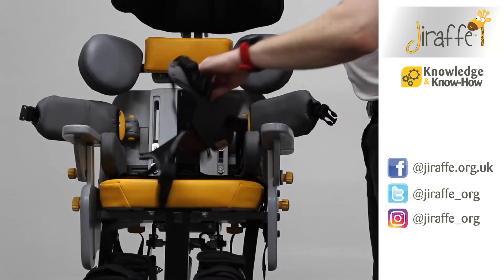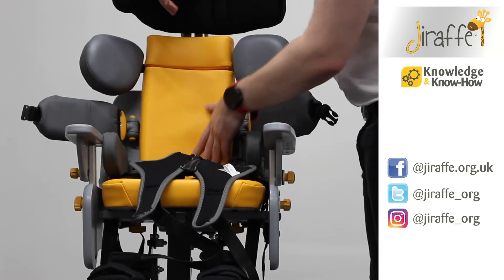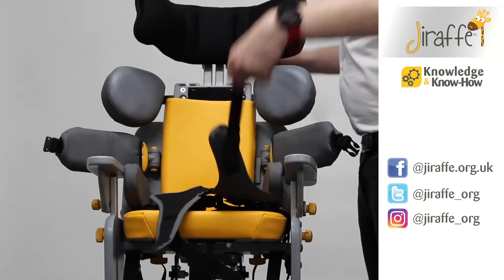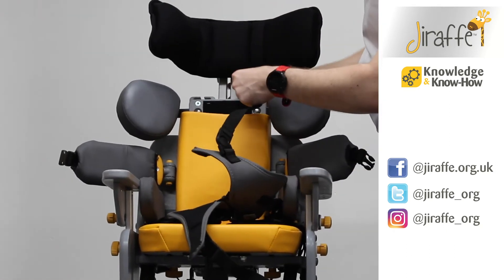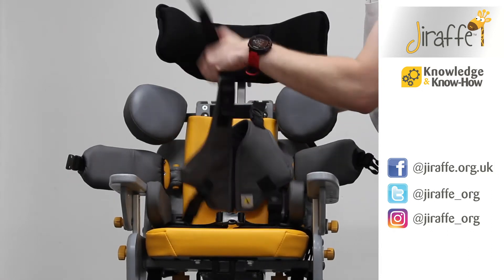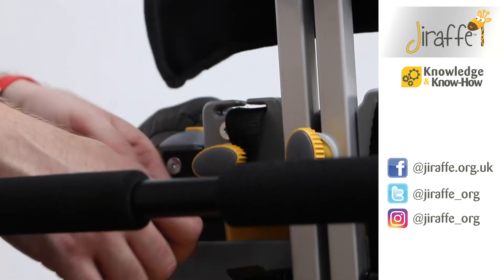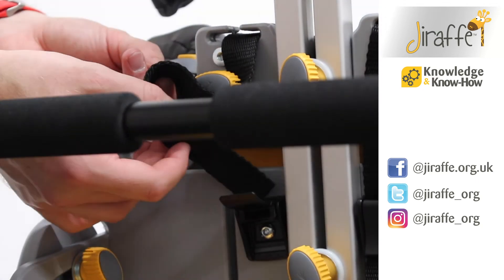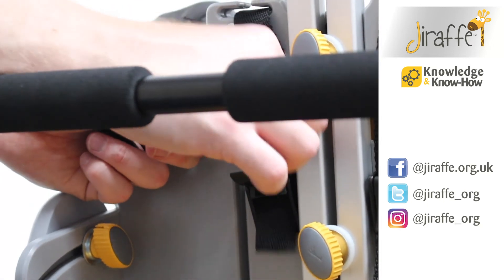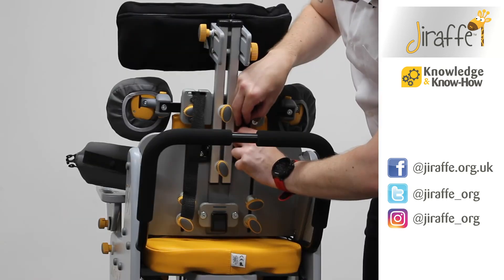We can now pop the back pad back into place. We can remove the shoulder pad, and we can then attach the shoulder straps through the plastic grooves in the shoulder support. Then on the reverse, we've got two more cam locks that will lock the straps in place.